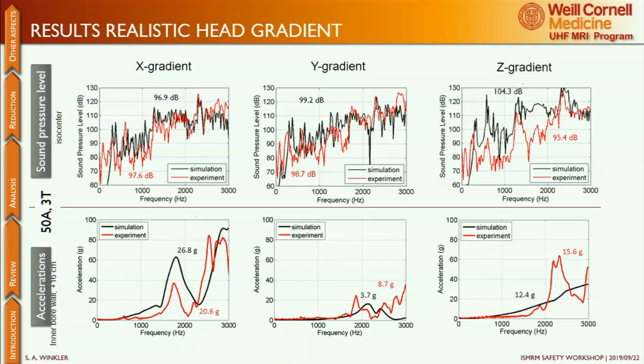Now, the Lorentz damping that I mentioned before is actually something I found while I simulated these gradients. And what happens here is that you have obviously these gradient conductors with a current running on them in the static magnetic field, causing a Lorentz force, as we mentioned. Now these move because they're vibrating. So they have a velocity v. And what that means is that you induce a counter current, proportional to this velocity v. And so the total current is reduced by this counter current.